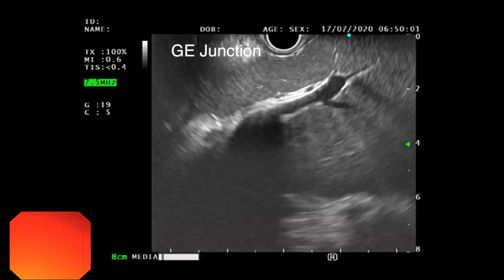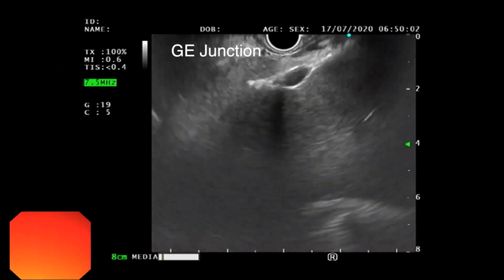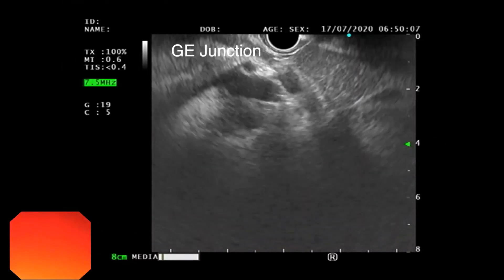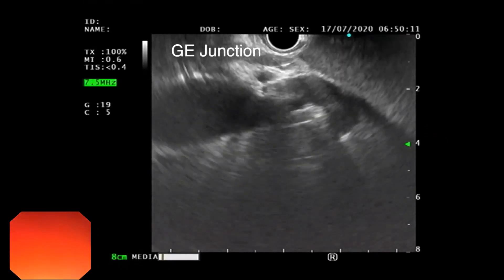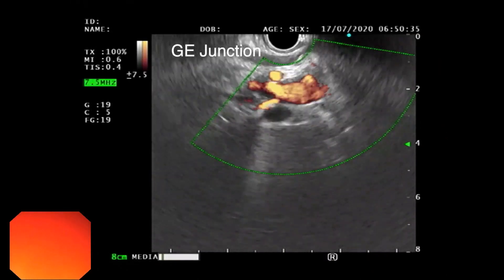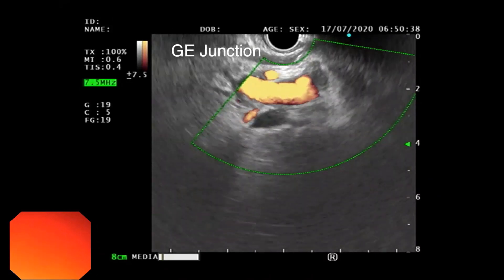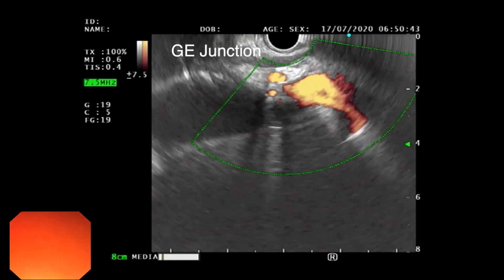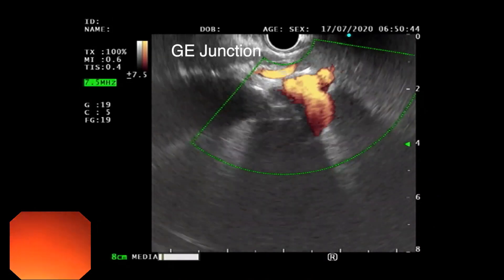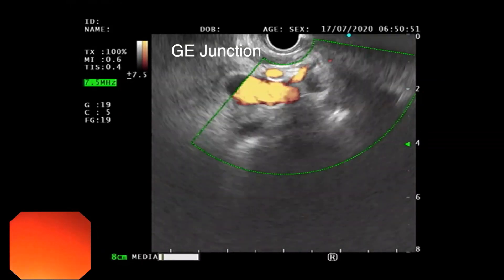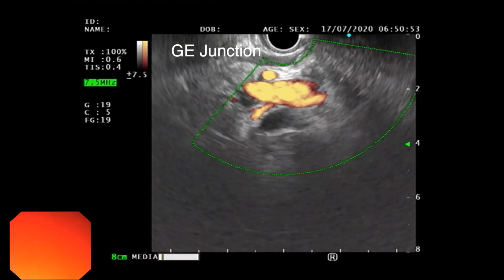On further clockwise rotation and slight forward movement of the scope, the hilar structures are highlighted. In the hilum, we can see three structures: the hepatic artery, the portal vein, and below that the CBD.